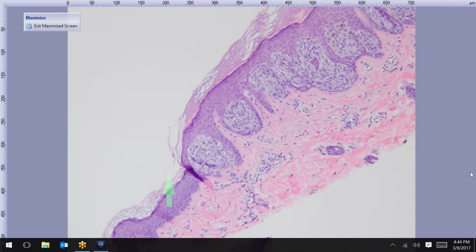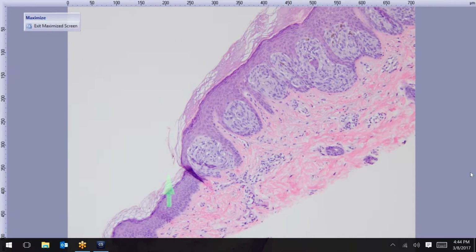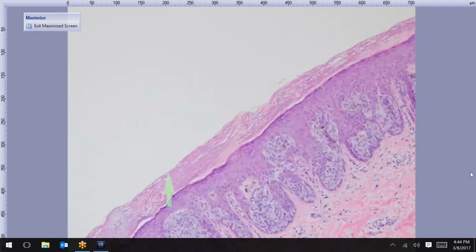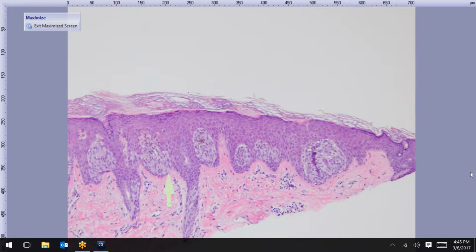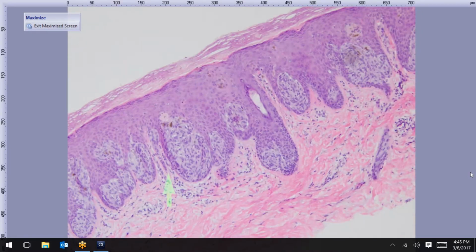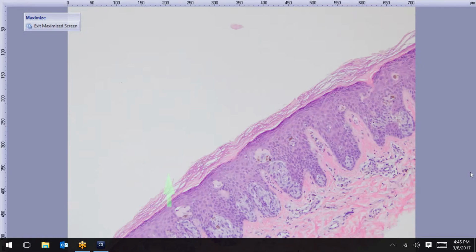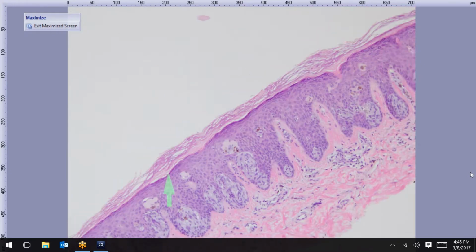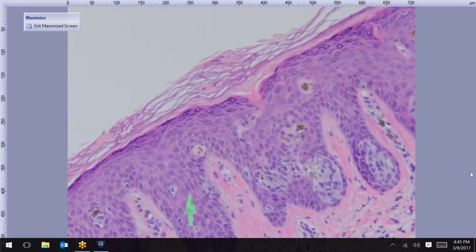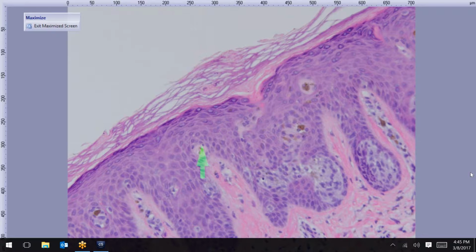That one right there. And that was good. Yeah, you got this melanocytic proliferation, starts and stops here, and starts and stops there. So it's really small, well-defined, epithelioid to spindle-shaped cells, and also, yeah, we really got a good example of Kamino bodies right here. So there's actually really numerous Kamino bodies in this.